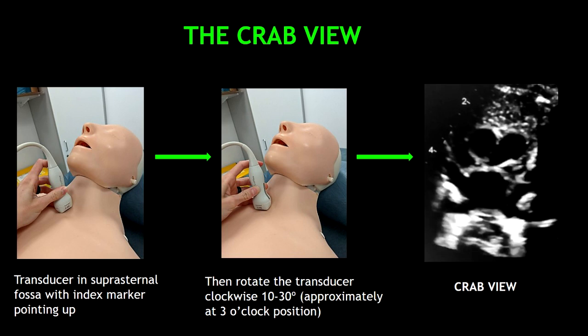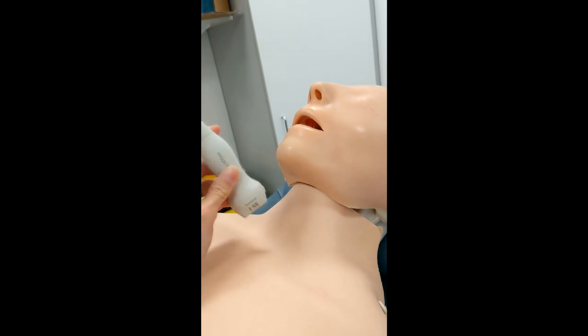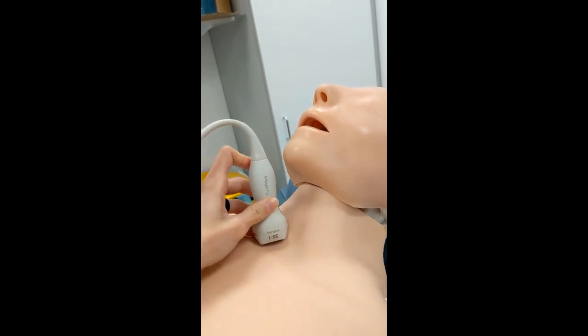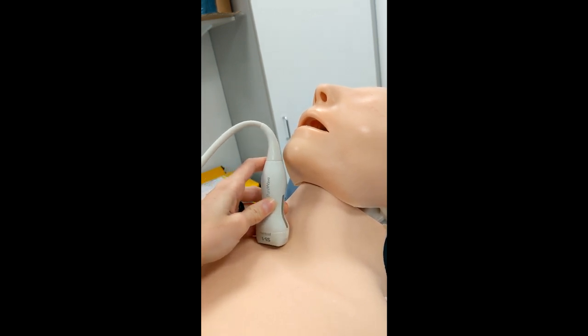However, remember that this view is often used in pediatric echocardiography and is very difficult to obtain in adults. Now I'm going to demonstrate how to get the CRAB view in a video. Place the transducer in the suprasternal fossa and rotate the probe clockwise 10 to 30 degrees.